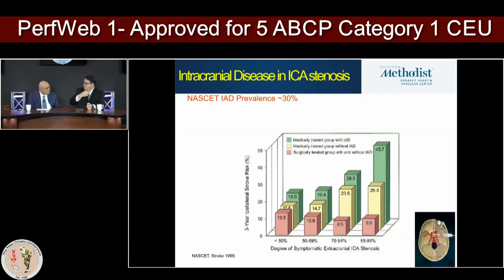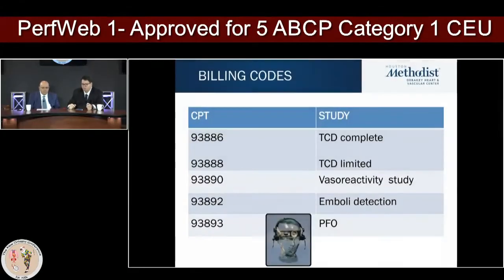So we are investigating only the extracranial part, and sometimes based on extracranial flow we can predict that there may be some disease distal. But I think the carotid ultrasound needs to be combined with the transcranial Doppler to really see what the blood flow is doing in the brain. So the carotid is definitely not enough to investigate the blood flow in the brain.